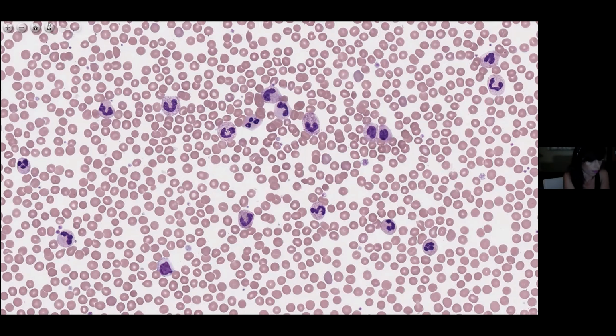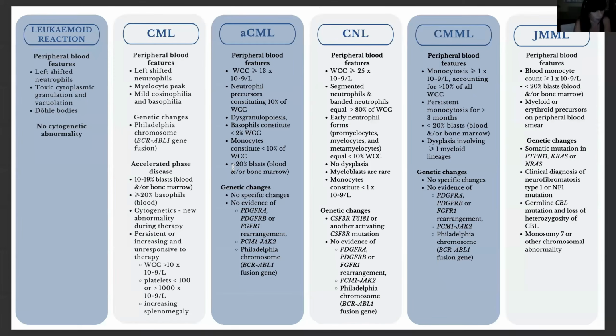Okay, so hopefully, can you see this table, Sam? I can. Yeah, perfect. Okay, so this is a very, very busy table. I'll break it down and try and go through the main points from it.